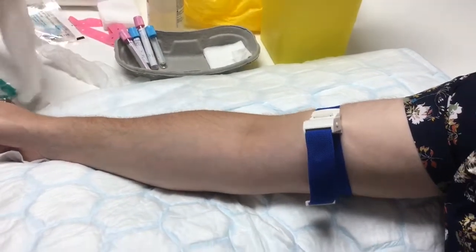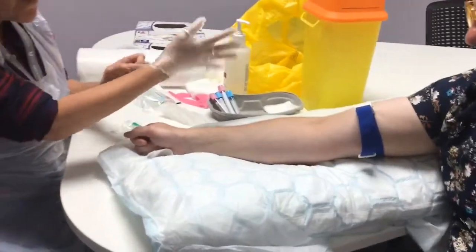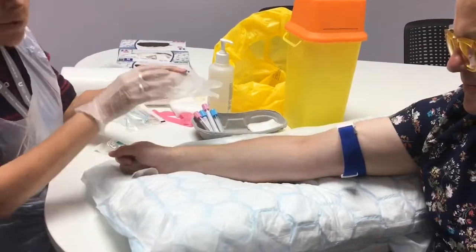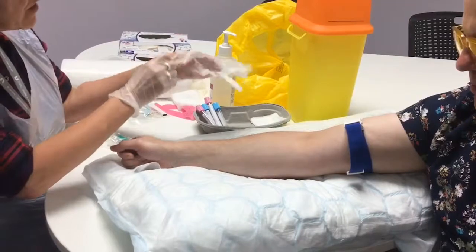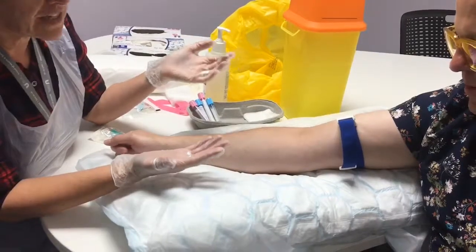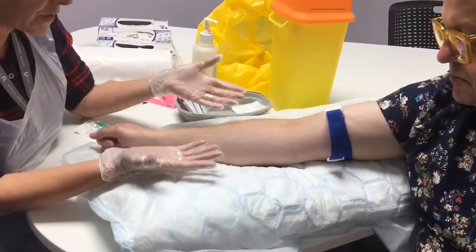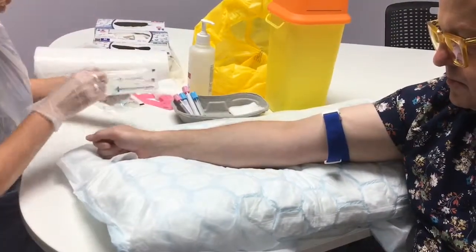While that's drying, I'm going to put my gloves on. You've got to wear gloves for these procedures. If you've seen in practice people saying 'I don't like to wear them, I can't feel anything' — that is inappropriate, it's not professional and it's risky. Your policy states you have to wear gloves because you are touching blood, and there's a risk to yourself and your patients.